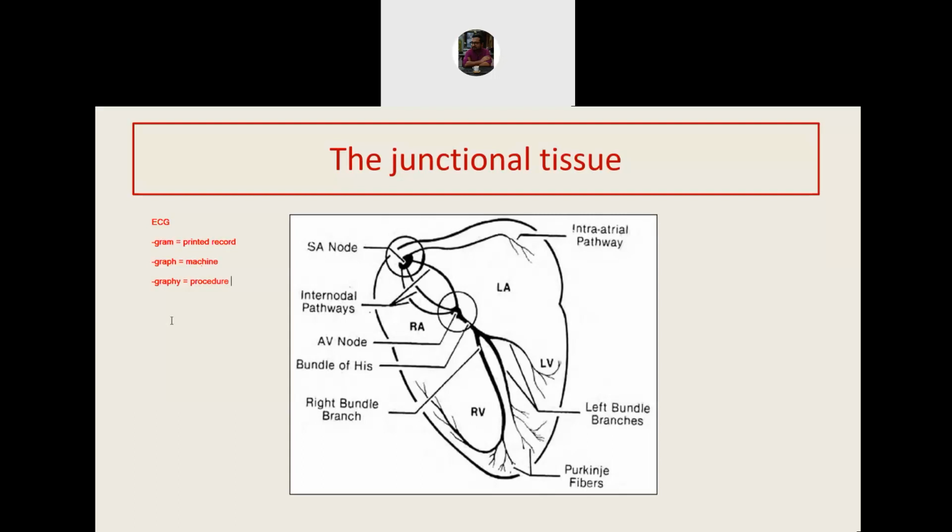Now, for recording the electrical activities of the heart, we really do not dissect the body and reach out to the heart. We place the electrodes on the surface of the body. And although we place them on the surface of the body, the electrical activities of the heart can be well recorded. This is because our body is full of electrolytes. And the electrolyte solutions, that is tissue fluid and blood, are very good conductors. So the whole body volume behaves as a conductor.